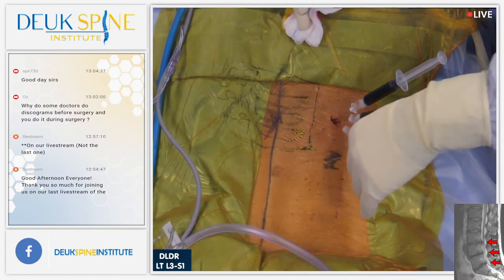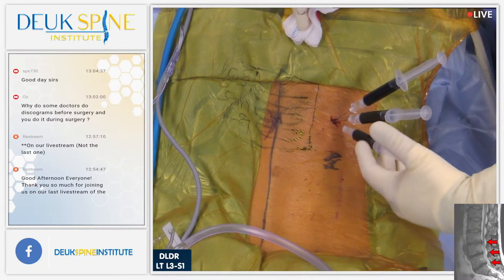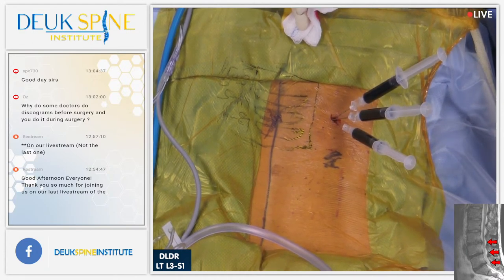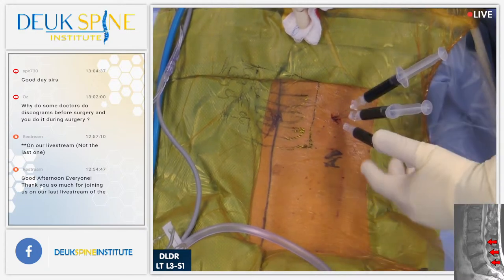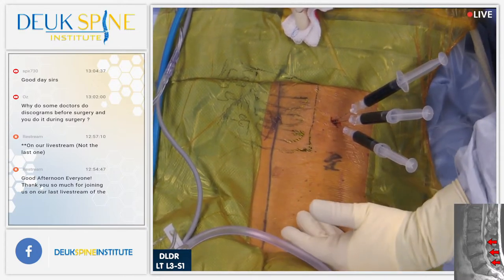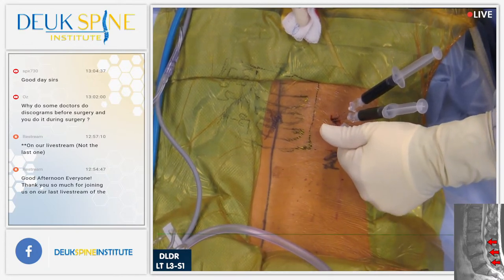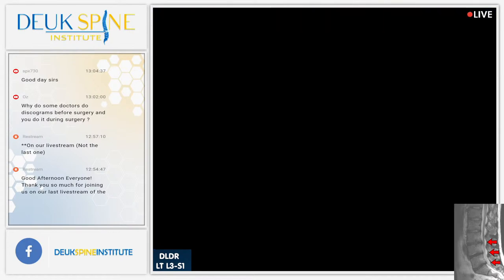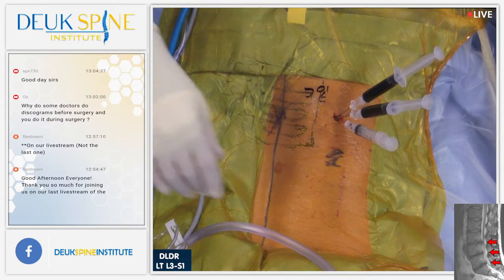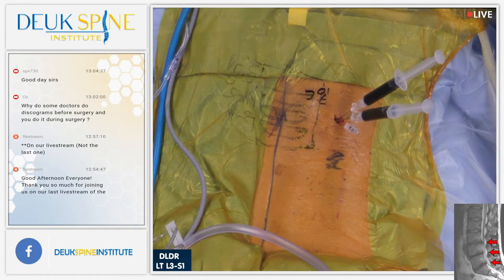All righty then. You comfortable? How are you doing? I'm good. He says he's good. All right. Any pain? Are you having any pain anywhere? Besides your nose? I know. Are you having any pain? Good. How bad is that on a scale of 1 to 10? 7. What's the highest it went? Seven. All right. 7 over 10. Yeah. Lay still. You're okay. The highest it is a 7? Yeah. All right.